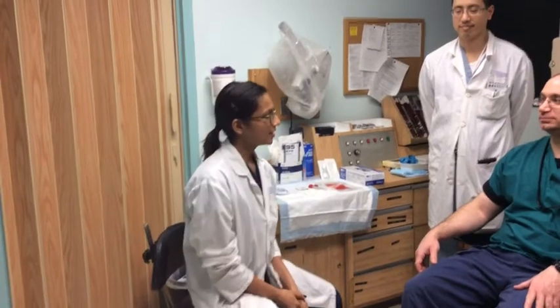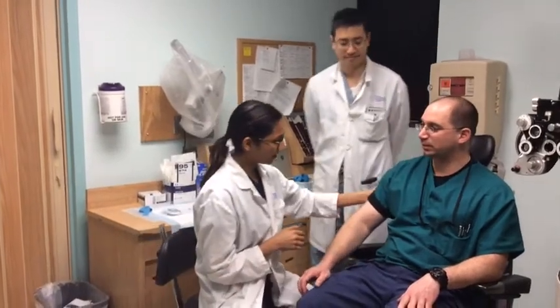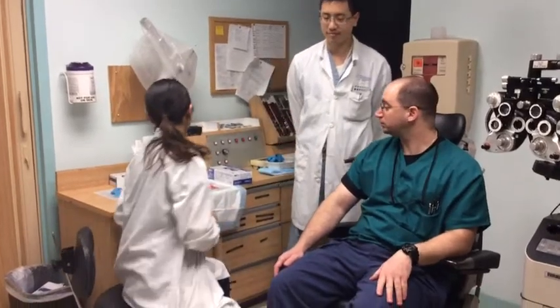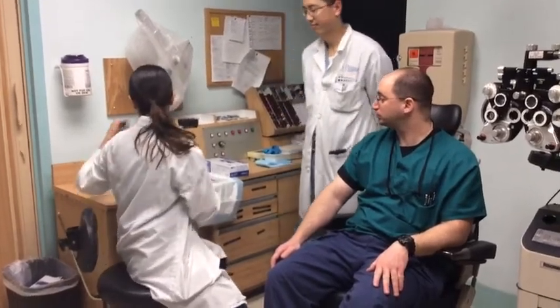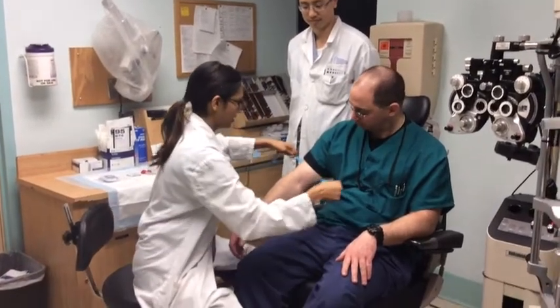We have Dr. Michael Datila, who has been brave enough to volunteer as our patient today, and Dr. Frank Sag, who is also going to be assisting us. So first things first, we've got our arm prepped here for the blood draw — the clothes are out of the way. We're going to go ahead and put on a tourniquet, nice and tight.